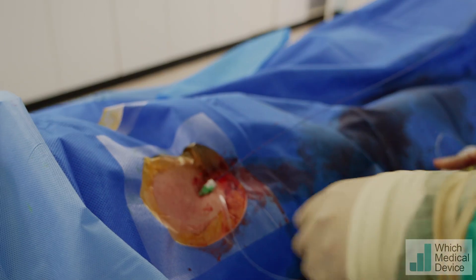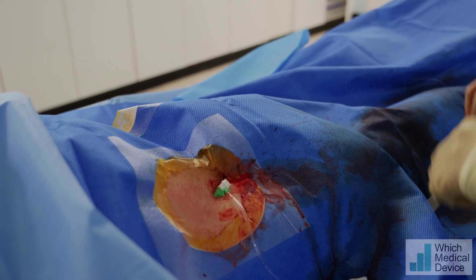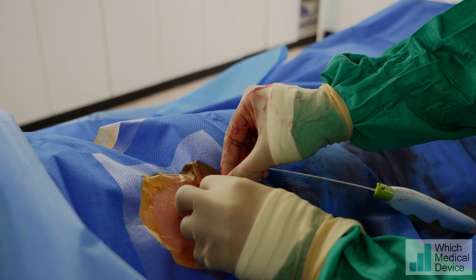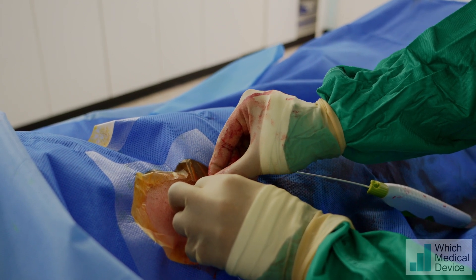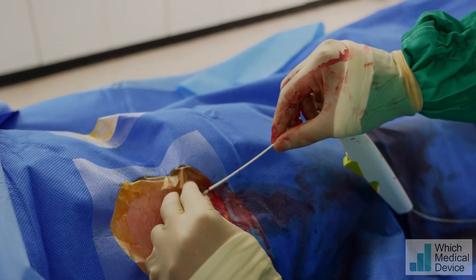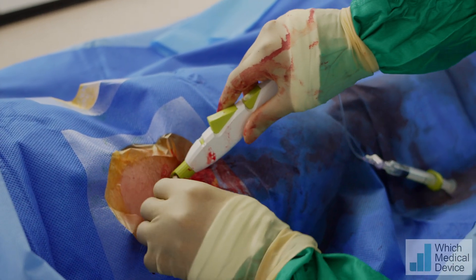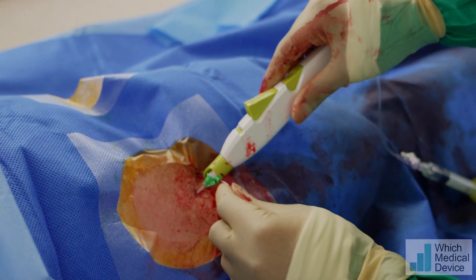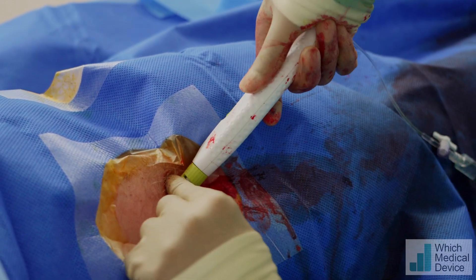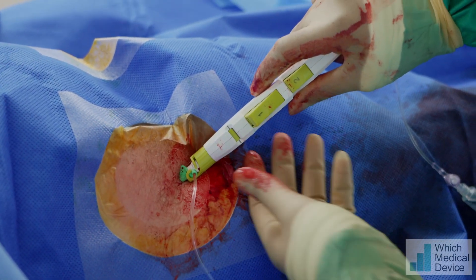We've got the 6 French sheath in at the moment, so at this point we can probably take the wire out. Now I've got the device here — the tip will just go through the end of the sheath. This can often be the trickiest part, but if you struggle to get it in at the top, you can use the dilator to give you a hand. As it's going in, I pull this back a bit — you can see this green thing is a ratchet, which is used to capture the sheath when needed. So we capture the sidearm here and then rotate the device, making it much more ergonomic to control.